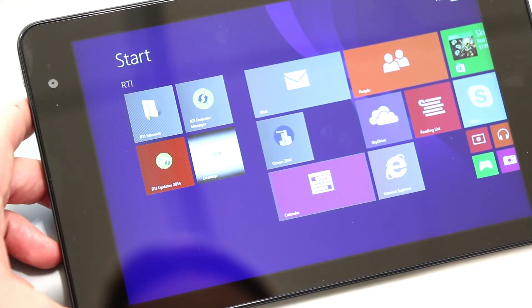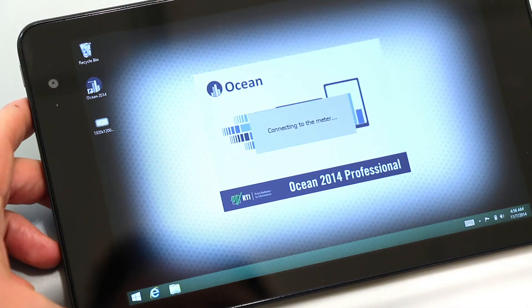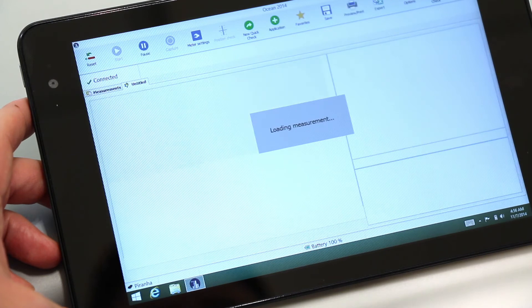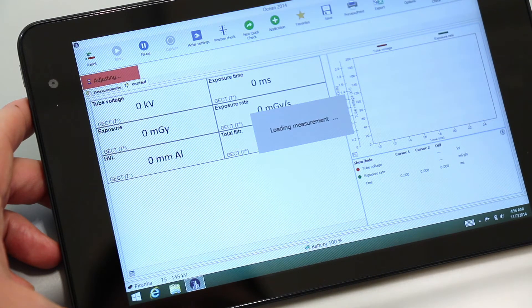Start Ocean 2014 on your laptop or tablet. Choose CT and choose which KV calibration you want. For normal CTs the 3mm aluminium calibration works, but for some newer CTs and tubes we have special calibrations.